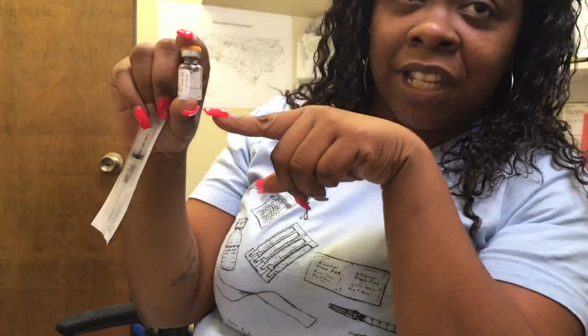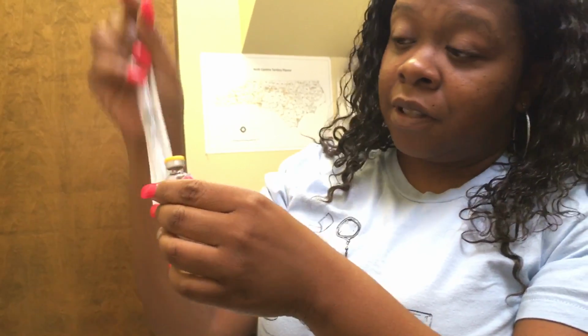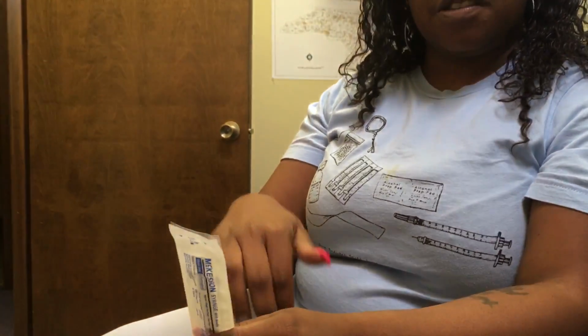Yeah. Is there a certain amount of force you have to use, or? You just want to make sure you get it in there, and you just draw the syringe up after it. So these are pretty cool. They're already pre-measured. So this is the amount that will be needed. You pop off the orange top. You stick the syringe in, you draw all of this medication because it's already been measured. You just want to maybe check for air bubbles, but you don't have to worry about measuring on this syringe. You're just going to draw all the medication up out of this vial. Again, the thigh, the arm, the booty, and you put the injection in.